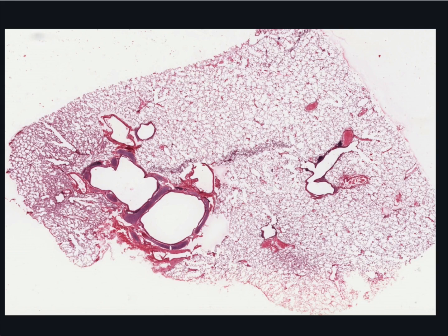This section of lung tissue is excellent for observing the smaller parts of the respiratory tree. The lungs that one normally sees after surgery or upon autopsy are more or less collapsed and gravely distorted from their patterns in life. To prevent this, steps were taken to avoid collapse of the smaller airways while preparing this tissue from a monkey.